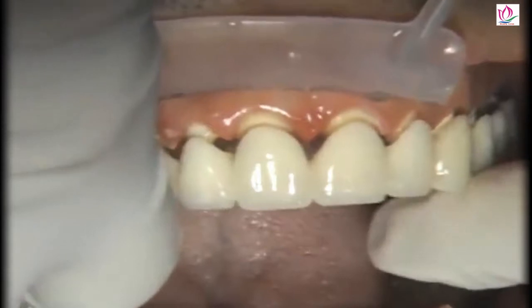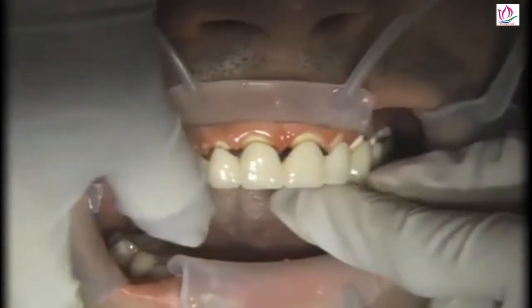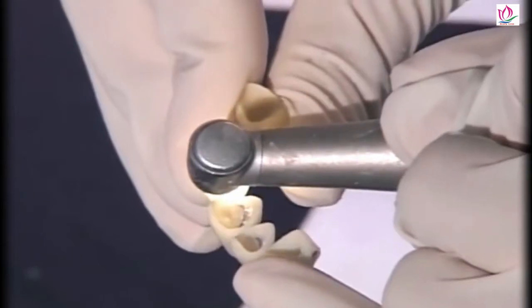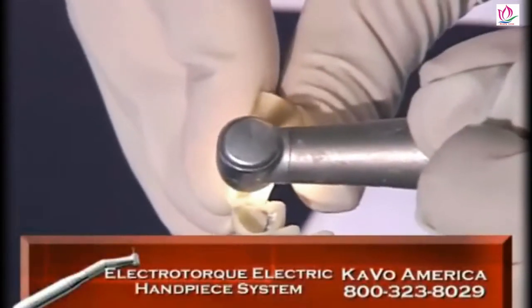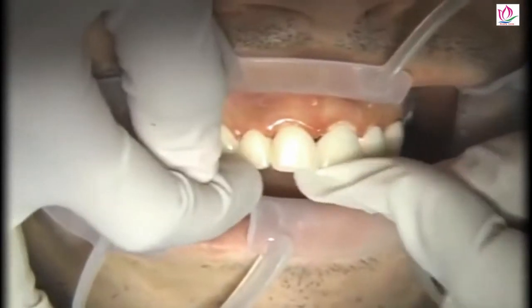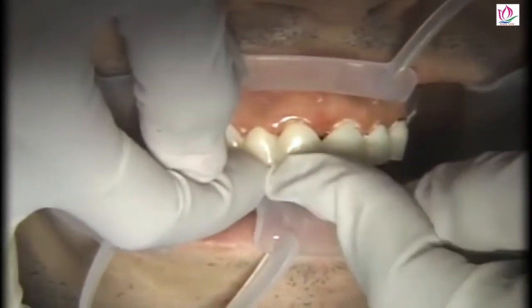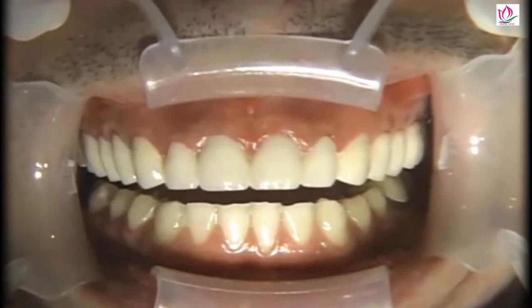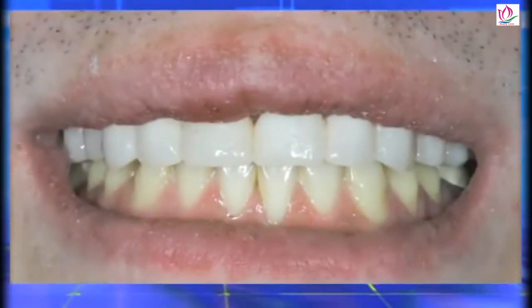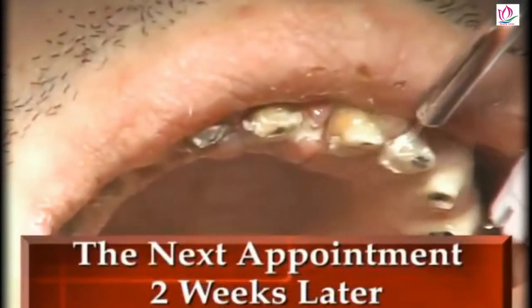When we try the biotemps back on again, they're not going to fit because they were relined at the last appointment before the post and cores were placed. So on those four teeth, I'm using a diamond on the electric handpiece — the Cavo Electrotorque — with the speed turned way down, to hollow out teeth number seven, eight, nine, and ten to try to make them look like the biotemps did originally. We try the biotemps back on the anterior segment and now that they're seating passively, we can re-reline these over the preps with the post and cores in place. If you remember what he looked like before, you can see that with the biotemps on we have a really great result, and the patient was very happy.